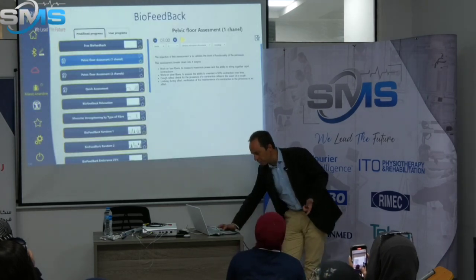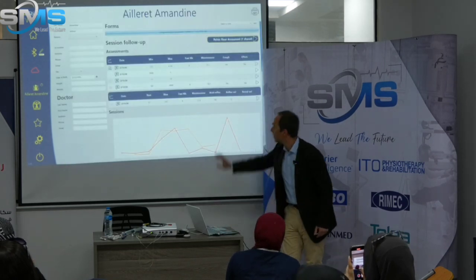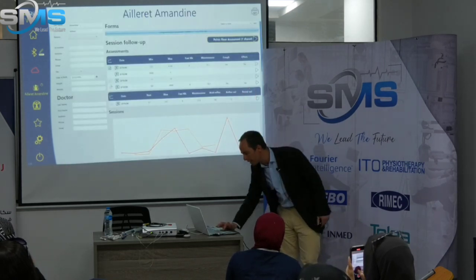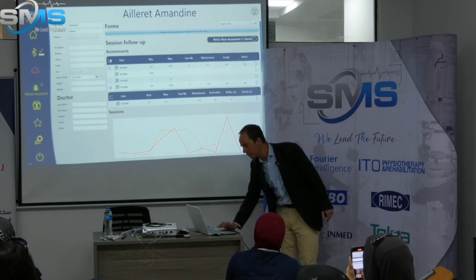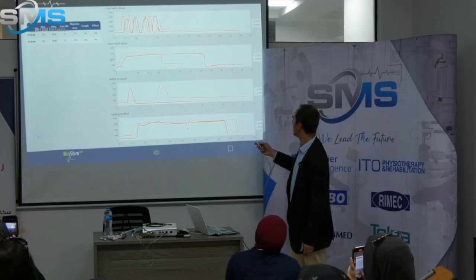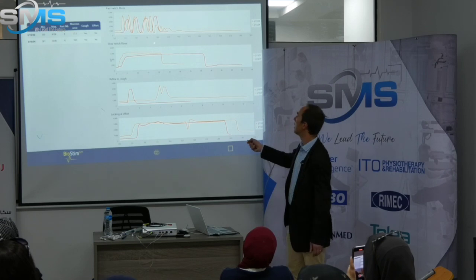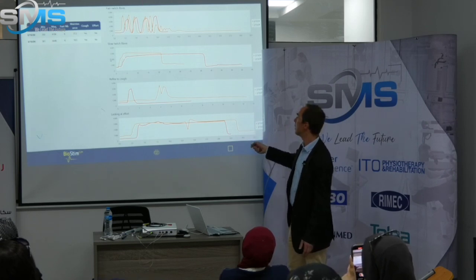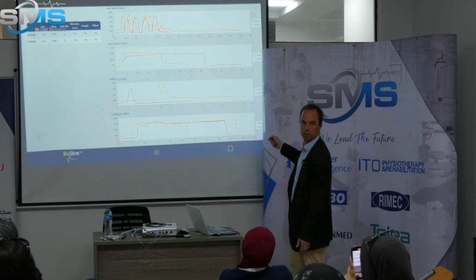And as I explained, I can get it back here in my patient file. I get back my assessment and compare it with previous assessments. You see? So here I can see that, sorry, yes, that fast fibers were okay and they're still okay. And here, slow fibers were pretty good, but now they're very good.